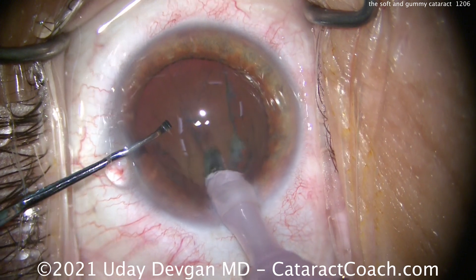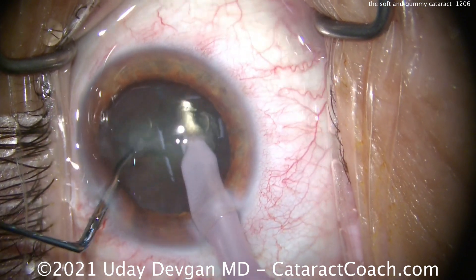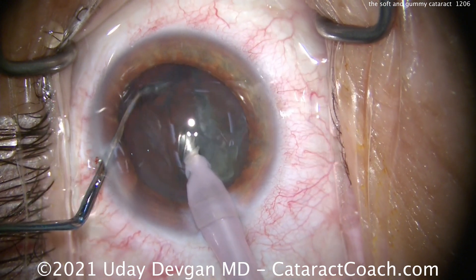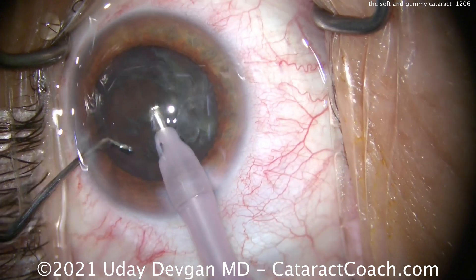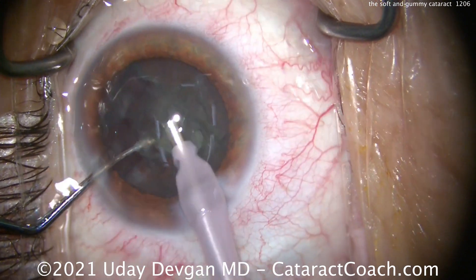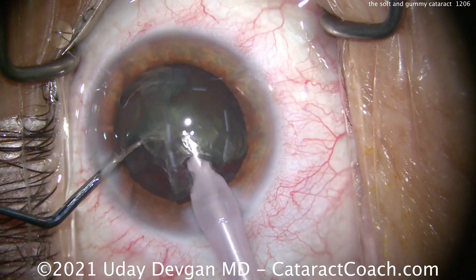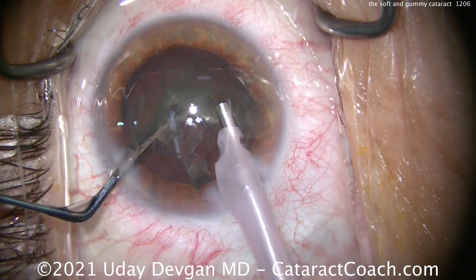Here comes the FACO probe, buzzing into the center. Here comes the chopper — and it just kind of doesn't want to split. I try to really propagate that chop, and it kind of doesn't want to do it. So it's a gummy cataract. I go behind with the chopper to try to really split the halves. I use the chopper to get underneath and try to bring part of the nucleus up out of the bag. On the foot pedal, not much FACO energy — mostly using vacuum here. Because if you give a lot of energy, you'll buzz right through that piece and hit the capsule. Just using vacuum to bring it up. Once I bring the piece up, I can give a very small amount of ultrasonic energy to help break up and aspirate that nucleus, and you see it comes up pretty easily. But again, it's gummy — I never really achieved the great chop you're used to seeing.